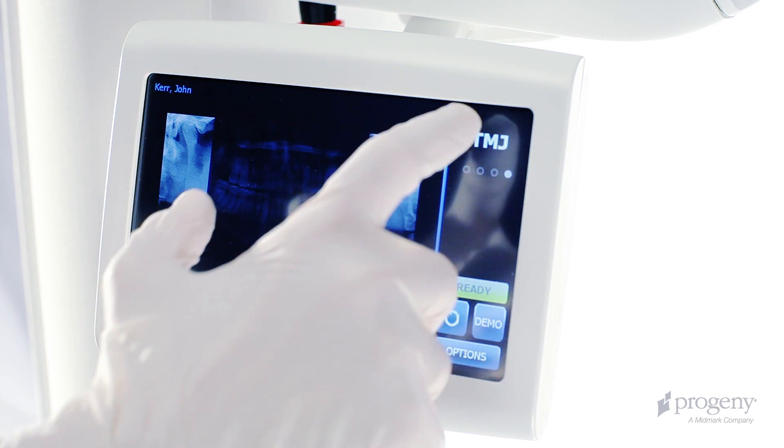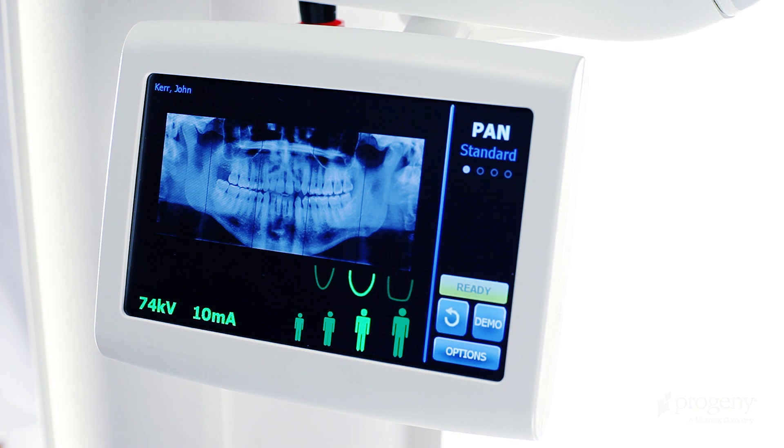Below the positioning table, we have the Vantage Touch operating panel.